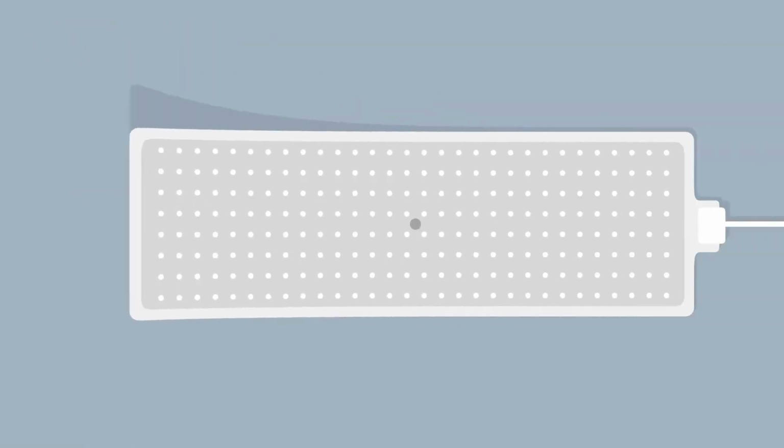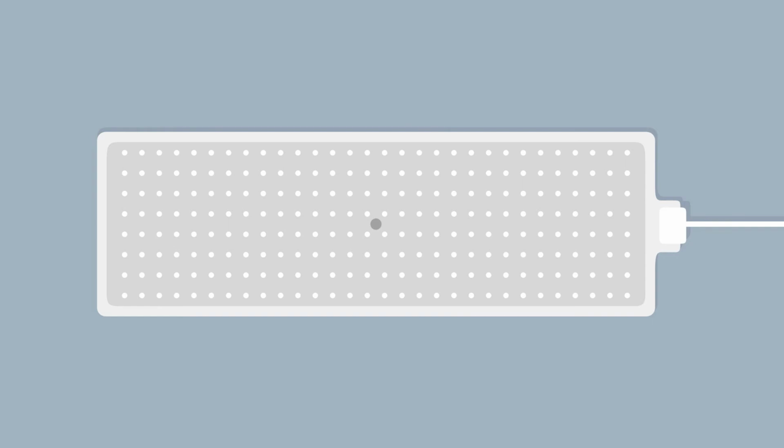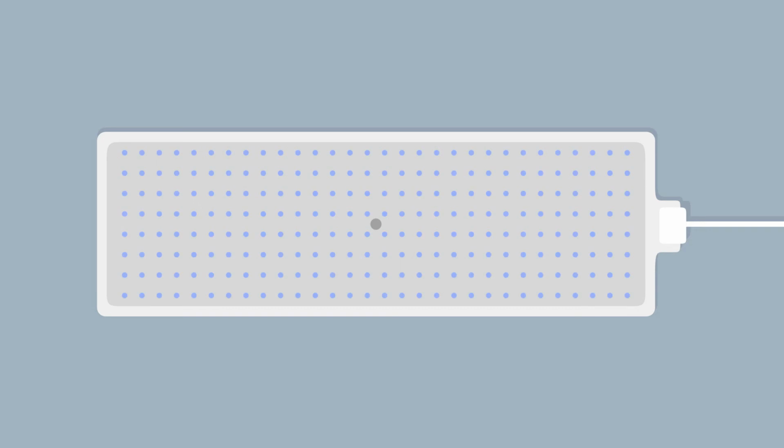The BiliTouch's light pad has a built-in LED module and temperature sensor. This temperature sensor measures temperature in the light pad to protect the patient from the heat of the LED. The illuminated area on the light pad is the lighting area from the built-in LED.